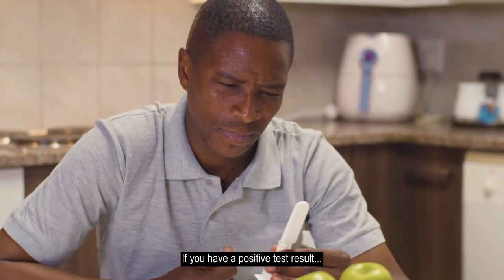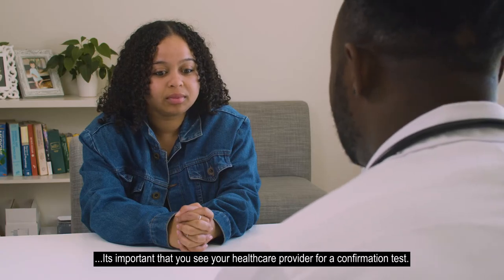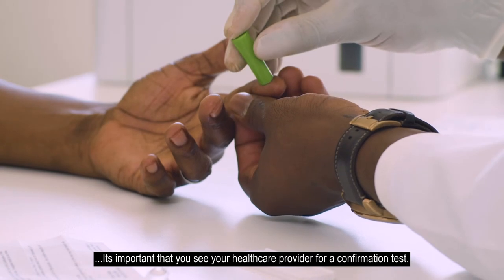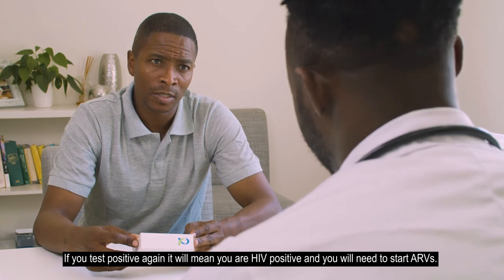If you have a positive test result, it's important to make a commitment to attend your clinic or healthcare provider for an HIV confirmation test. If you test positive again, it will mean you are HIV positive and you will need to start ARVs.